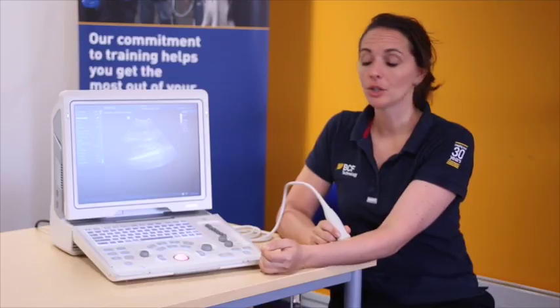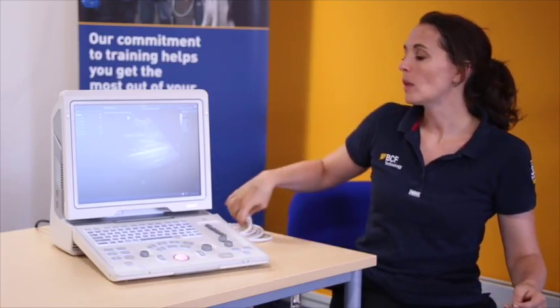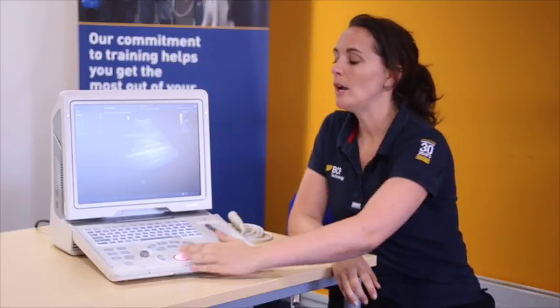Once we're happy with our image, we just hit the freeze button. By doing so, the machine will not only capture that last still, but also retrospectively save the cine loop that you've been scanning.